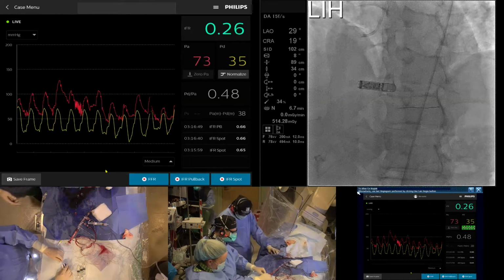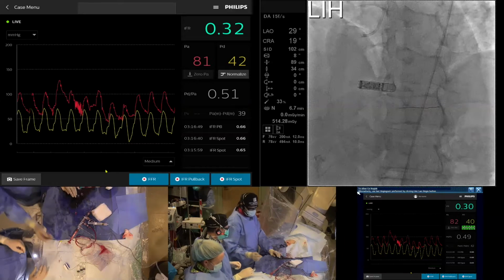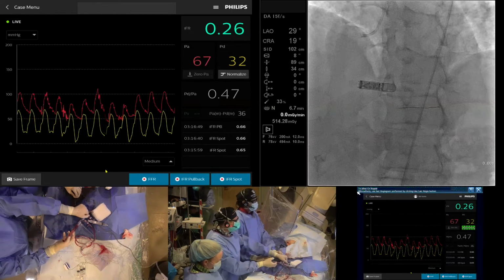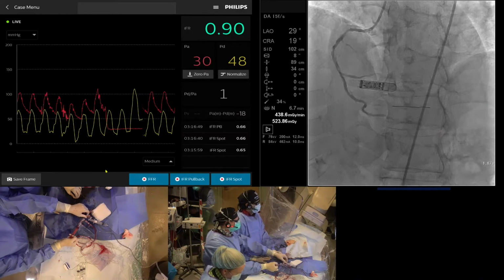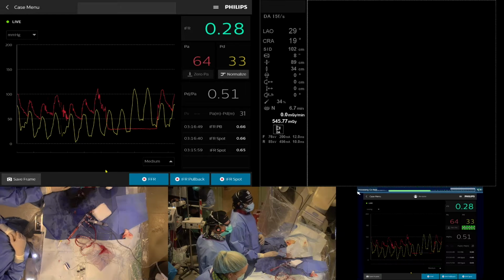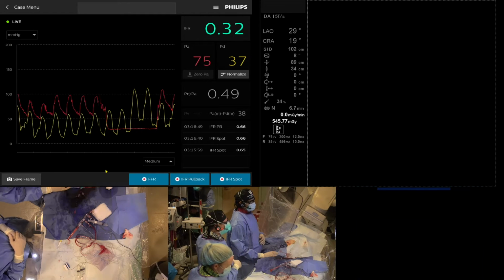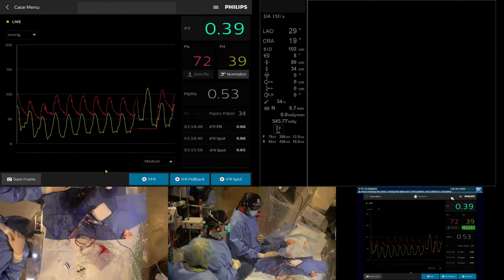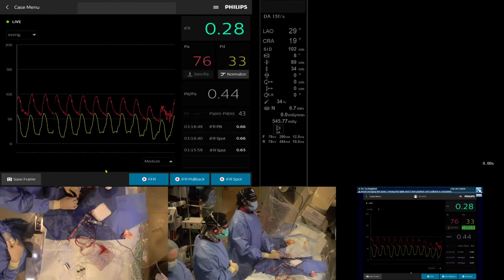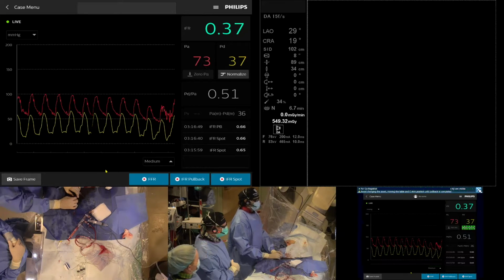We're going to take a little picture here. So let me disconnect this. I'll take a picture so we can do the sync. Go. Now, look at this, 0.28. This is with contrast. I guess I'm in a tiny branch too. So, FFR.